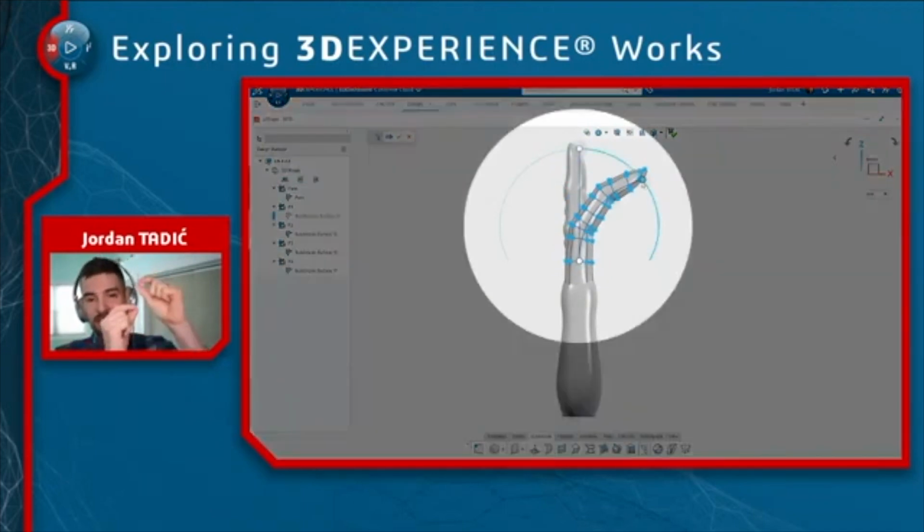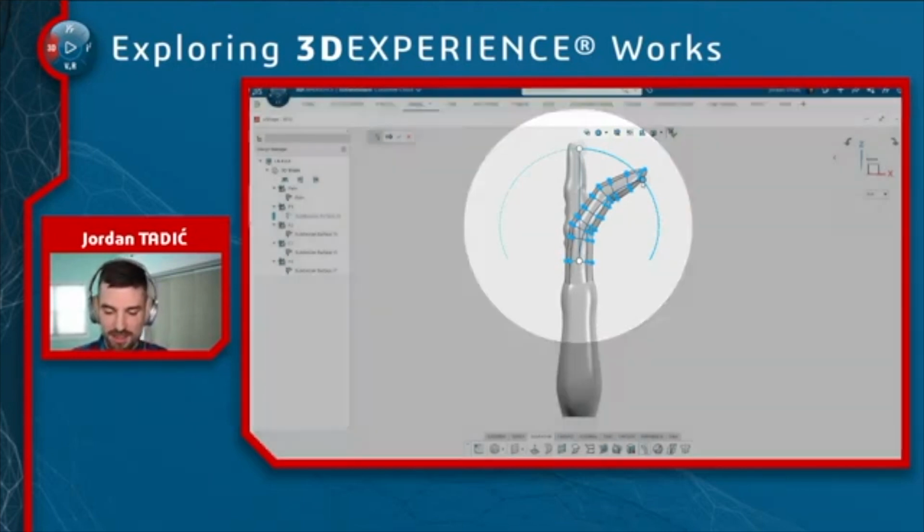So just like the flex tool, it has a vertical line. You can make it horizontal depending on how you're orienting it to your model. But that vertical line in this case is also defining the range of the bend. So again, if I tighten it up, it's going to have a tighter radius of curvature. If I lengthen it, it's going to have a more sweeping radius across the length of this finger. And then you just drag the arc and bend these entities around. So let's see what that looks like.